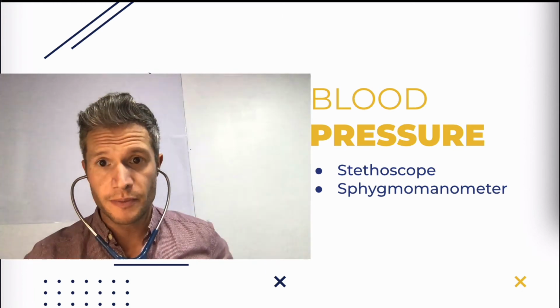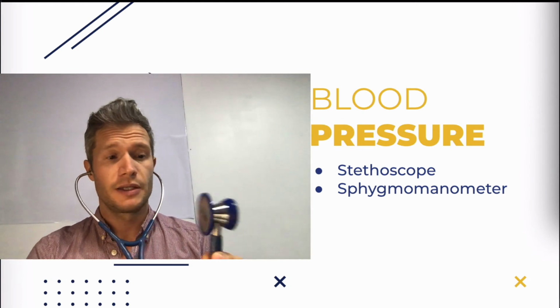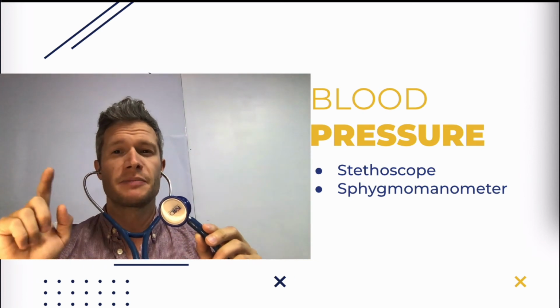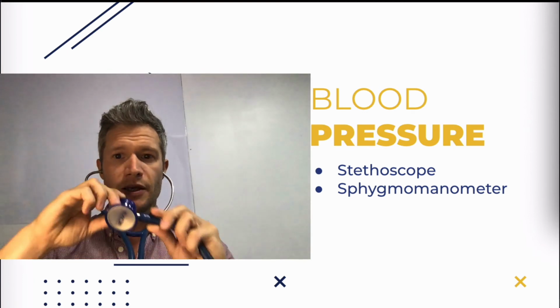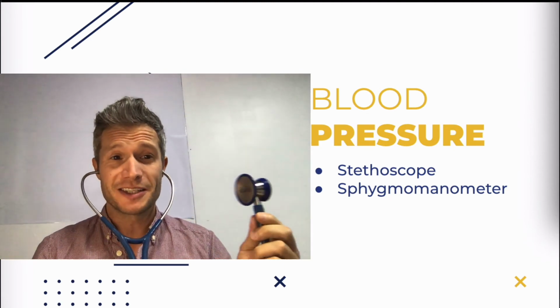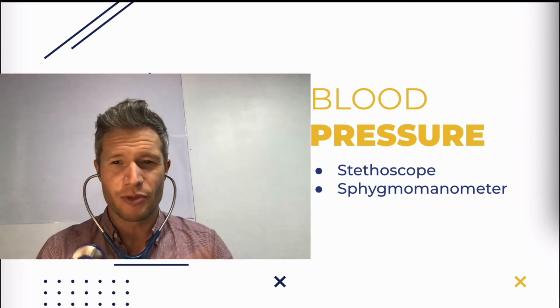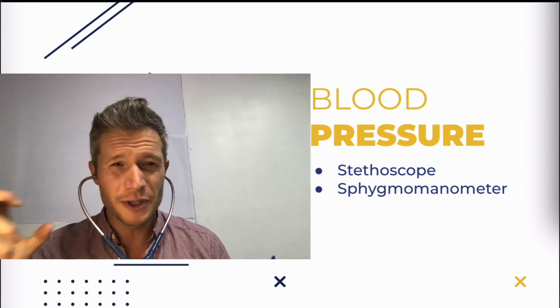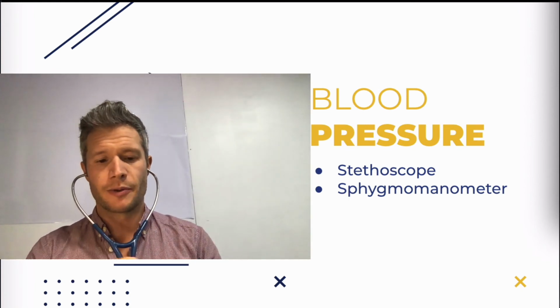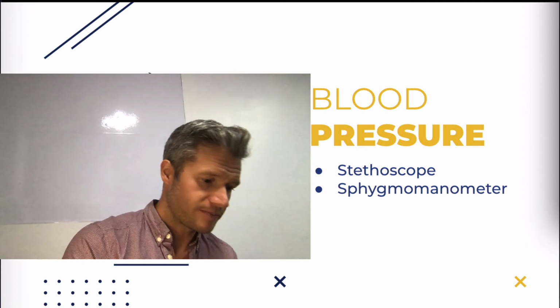Okay. So from here, you can carefully check to see if it's on. To make sure the stethoscope is on, you very lightly tap the drum. You should hear tap, tap, tap in through the earpieces, okay? If it's off, you're not going to hear anything. That's important because as you're learning to take your blood pressure, you're listening really close for some very subtle sounds, and if nothing's coming through, you'll be trying to figure out why. You're just going to want to make sure that you can hear, okay? And so that's the stethoscope, and those are those sides.